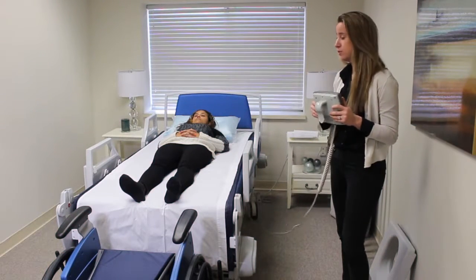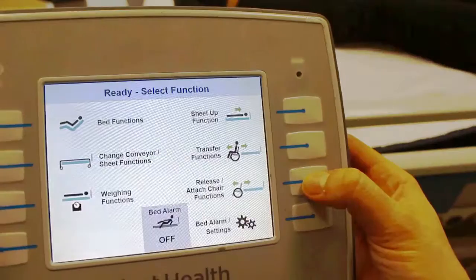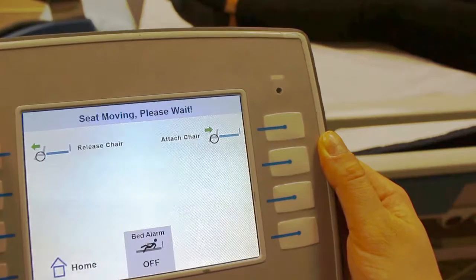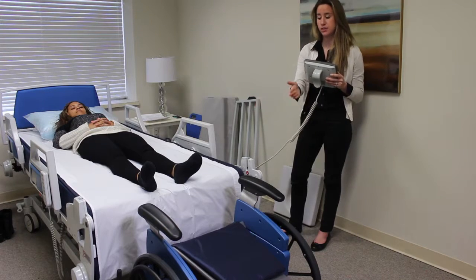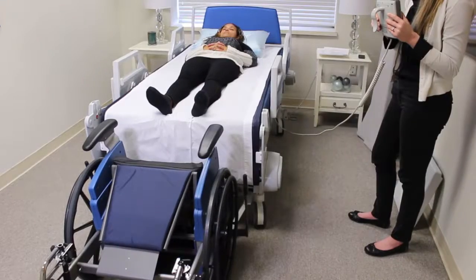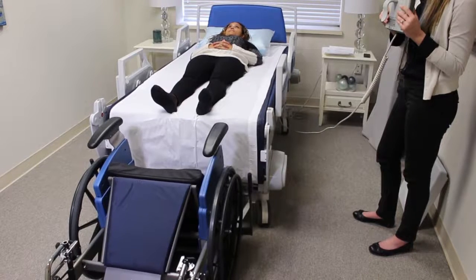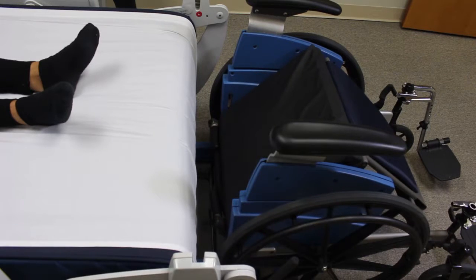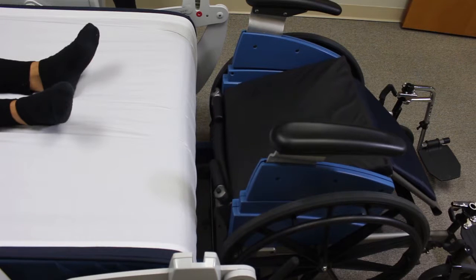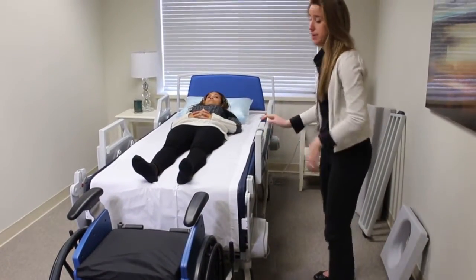When the client is ready to use the commode and they're in bed, the first step is to go to release attached chair functions. You then press release chair. You can see that the chair is moving forward and rotating, and when you hear a beep it's going to tell you to lift the back of the chair, but you don't need to if you're transferring them into the commode chair.